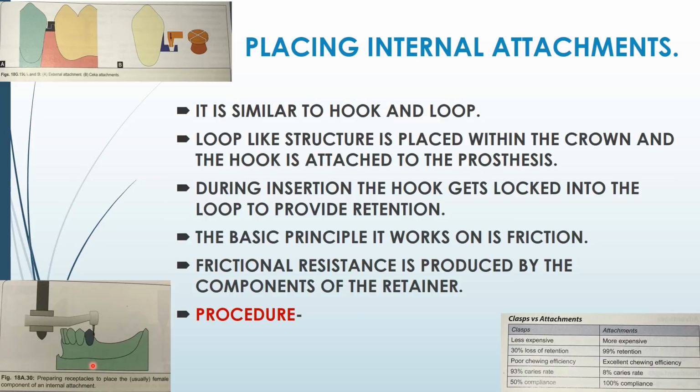So basically it's an additional use of it, and the abutments are positioned in reference to this with the help of a surveyor. Now all the attachments that belong to a single prosthesis should be parallel to one another. So you're just determining the path of insertion.